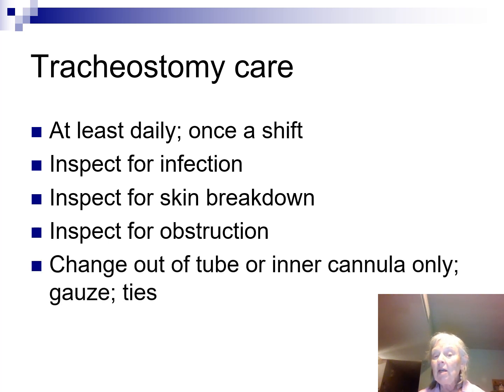We're going to change out either the entire trach, the outer and the inner cannula. Most times we're only going to change the inner cannula. We are going to change the gauze. We also are going to change the ties.